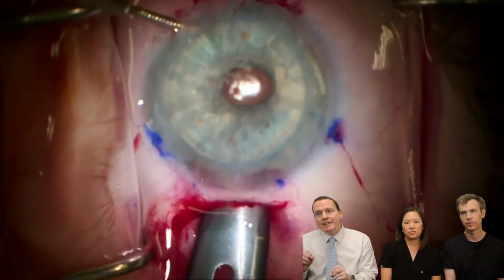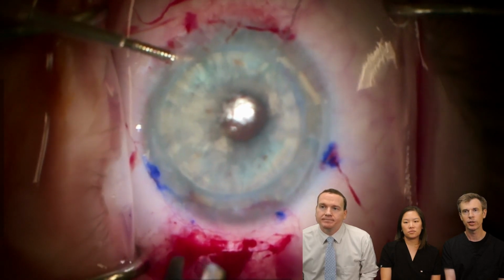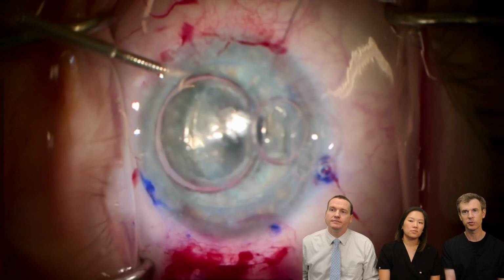Starting with just a little view of a DSEK graft getting placed into the anterior chamber. So it's still very thin tissue, unfolds as you can see immediately. Biggest difference is that DSEK tends to unfold by itself. DMEK, there's lots more work involved.